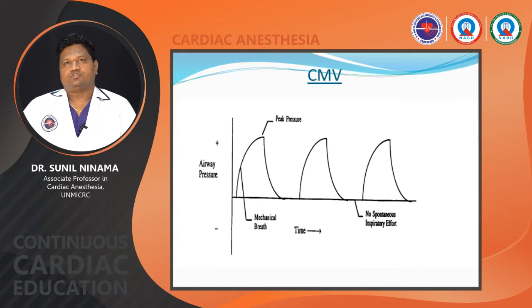This is the diagram showing the control mode, controlled mandatory ventilation. You can see that a mechanical breath is given to this patient, and there is no spontaneous inspiratory effort. So this patient is completely sedated and muscle relaxed.